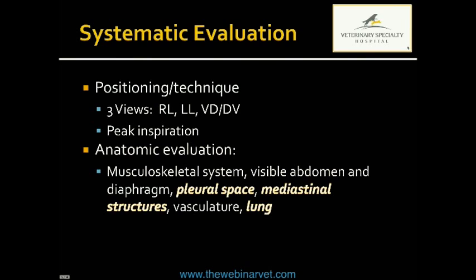And it's important because obviously when they're in one lateral versus the other, you're really only highlighting the non-dependent lung field. So to really get a thorough evaluation of all lung fields, the 3-view thoracic series would be the gold standard.